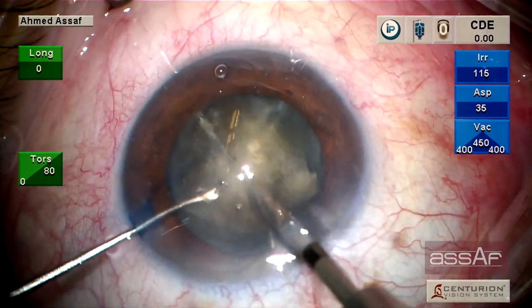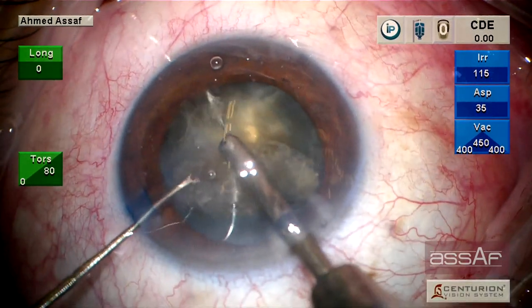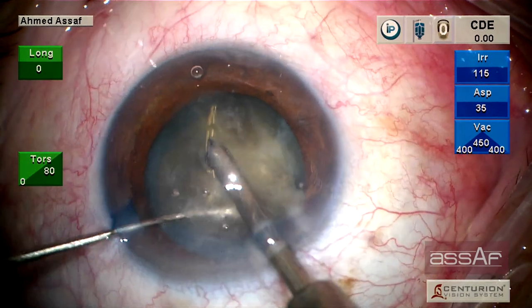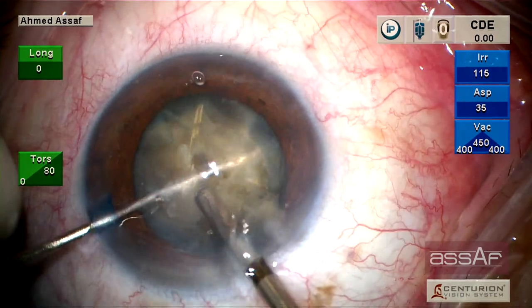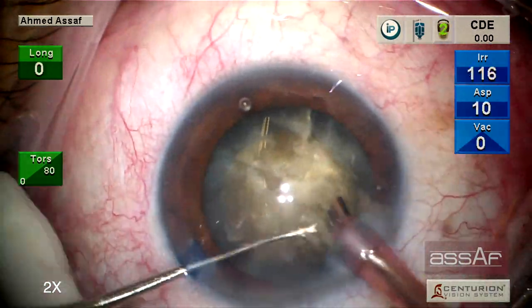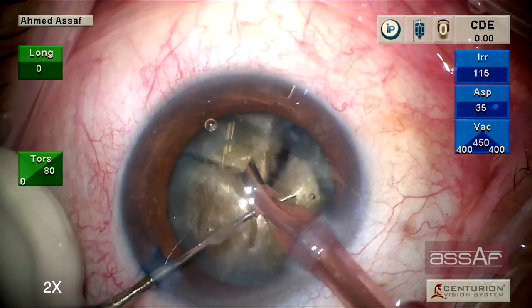Make sure while expanding the MyLoop to accommodate both halves of the nucleus. We cannot see the silver reflex in this case, but we can over-rotate the MyLoop about 270 degrees to make sure it has accommodated both halves of the nucleus. With a small pronation movement, we can bring it back to the vertical orientation, and with retraction of the lever, the MyLoop will cut each half into four quadrants. Now the lens has been divided into four completely separated quadrants.